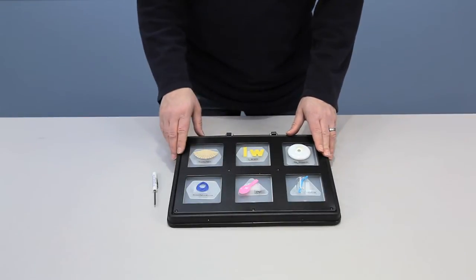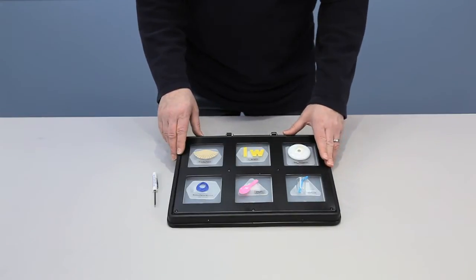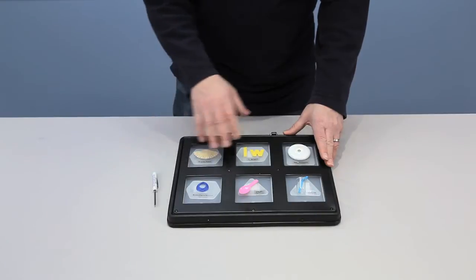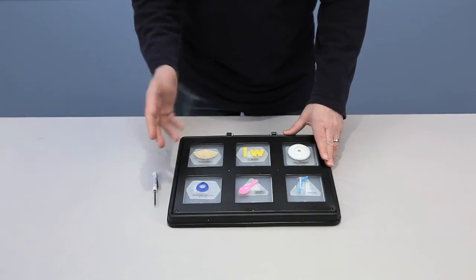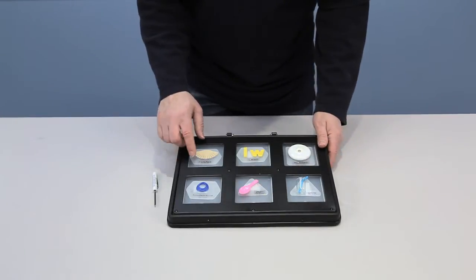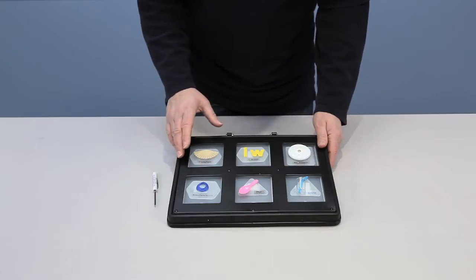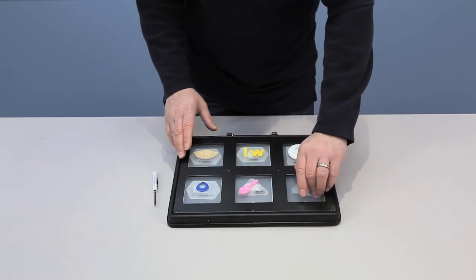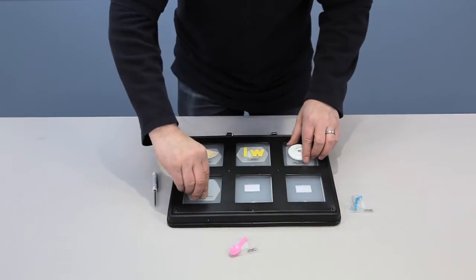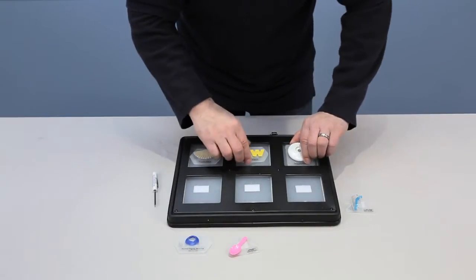The device also has what they call levels, and you can have six different messages per level, which gives you a total of thirty-six messages to record. The record time for each location is about six seconds.